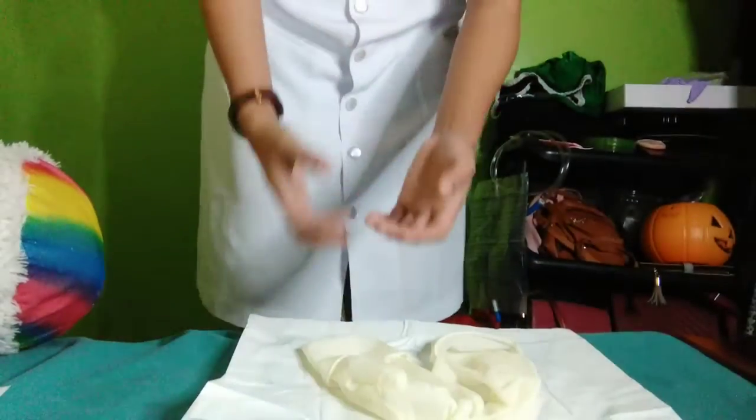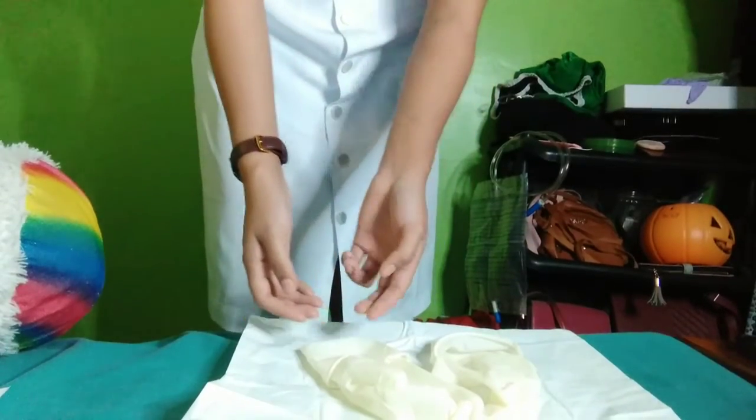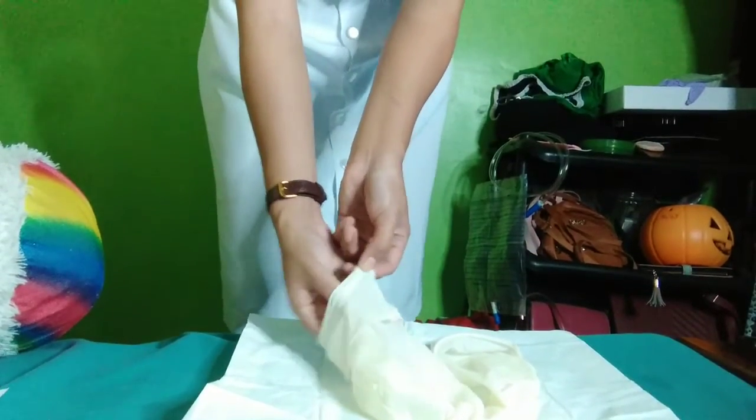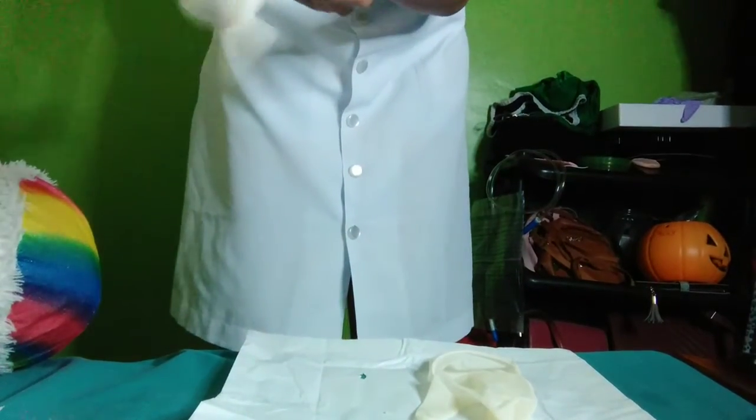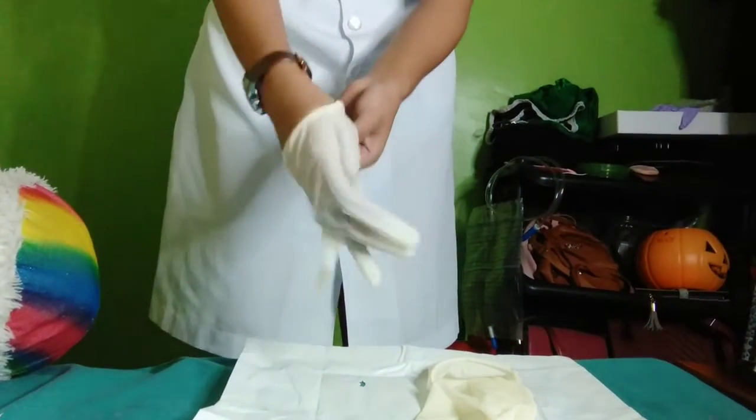So, apply the sterile gloves using the sterile technique. This reduces the transmission of microorganisms.